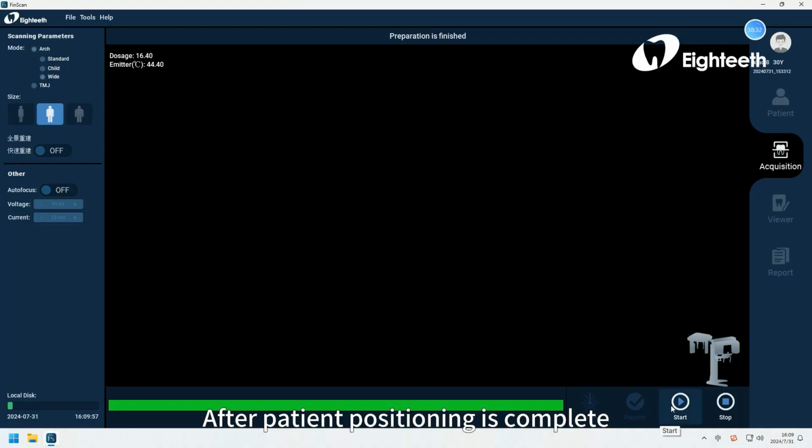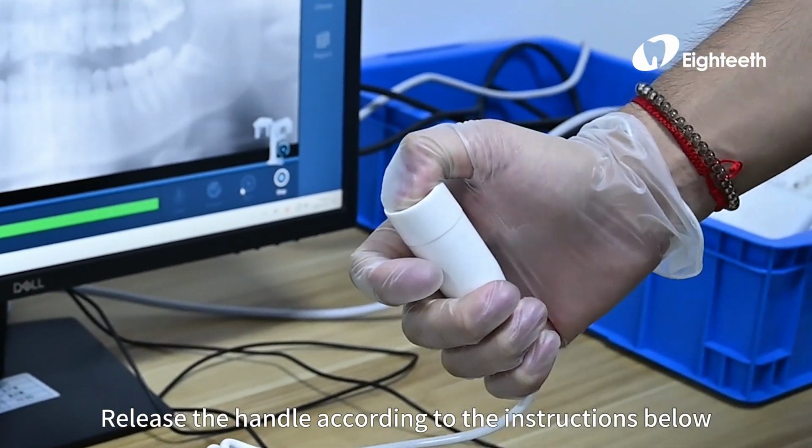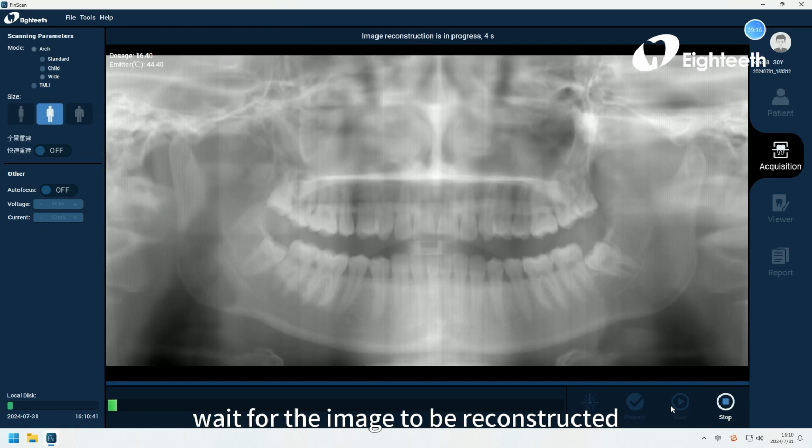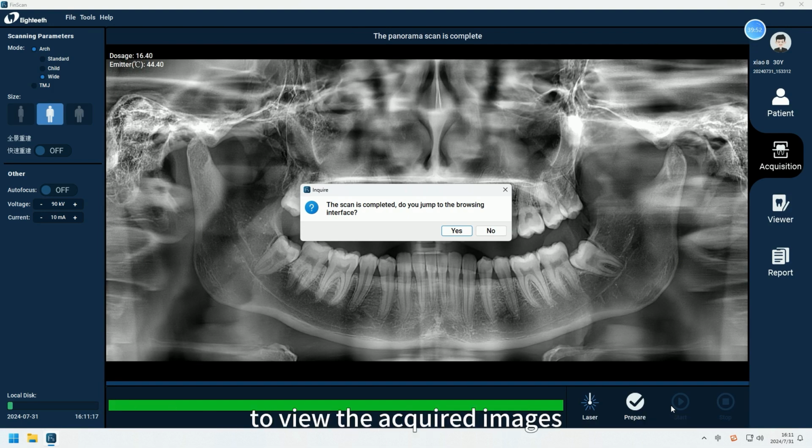After patient positioning is complete, click on the Start button to start shooting. Push the exposure button according to the instructions. Release the handle according to the instructions below. Wait for the image to be reconstructed. After the imaging is complete, double-click on the patient management interface to view the acquired images.